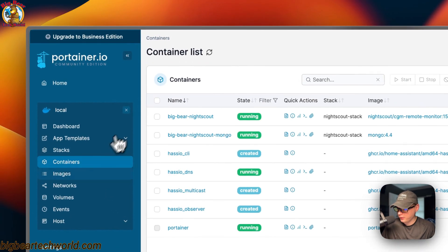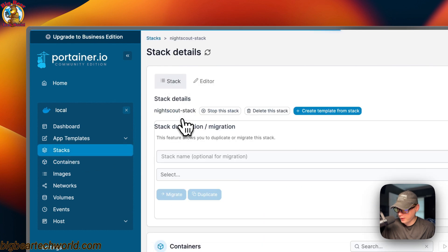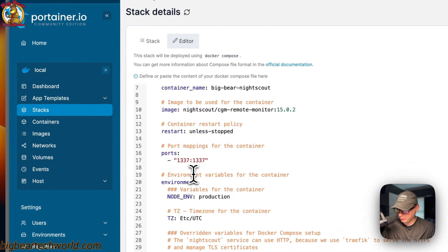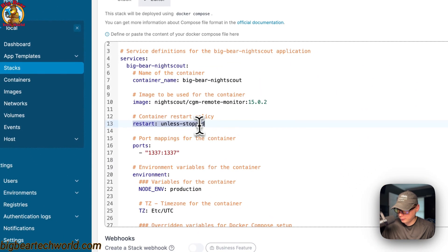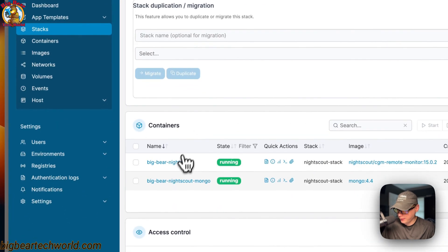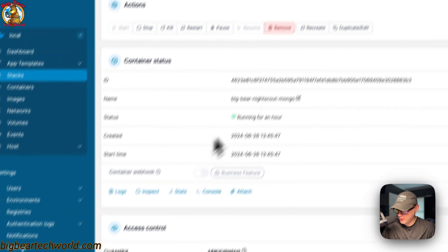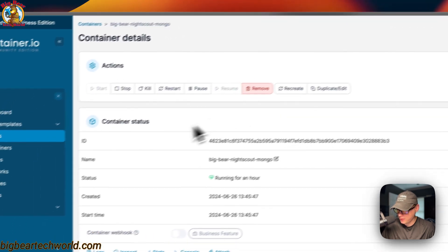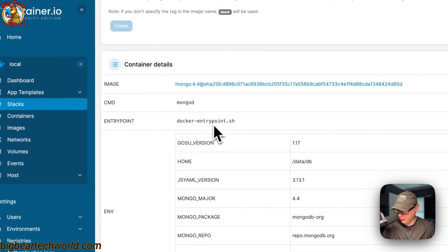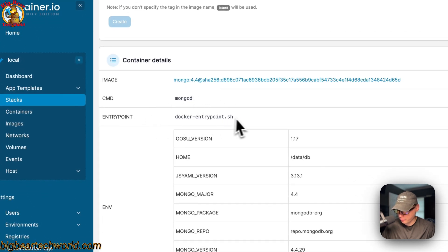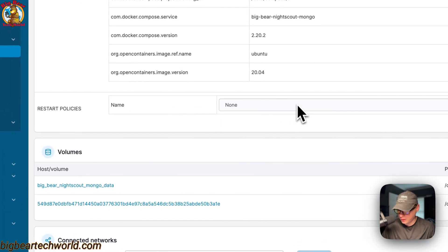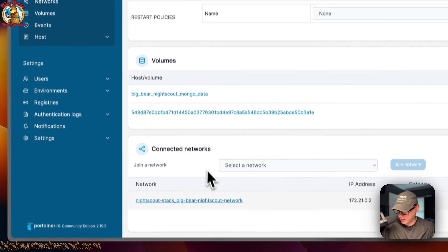Going back to Stacks, into the Nightscout stack editor, you can change the restart policy there. For the 'big-bear-nightscout-mongo' container, you have the same actions and status information, including container details, image, command, entry point, environment variables, labels, restart policy, volumes, and connected networks.